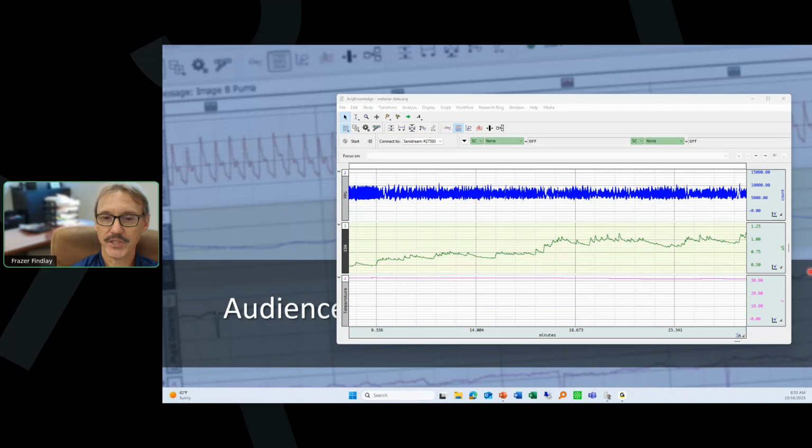earlier when I was talking about applying gel to the electrodes and making sure you let the electrodes sit for 5 minutes. The reason for letting the electrodes sit for a few minutes before you actually start to record data is that it helps to make sure that the gel is penetrating the skin, and then you reduce the impedance levels between the electrode and the skin surface, and then you get cleaner signals. If you just put the electrode on right away with the gel and you start recording, you'll still sometimes get a little bit of noise. So this way, letting that gel penetrate for a few minutes really helps.